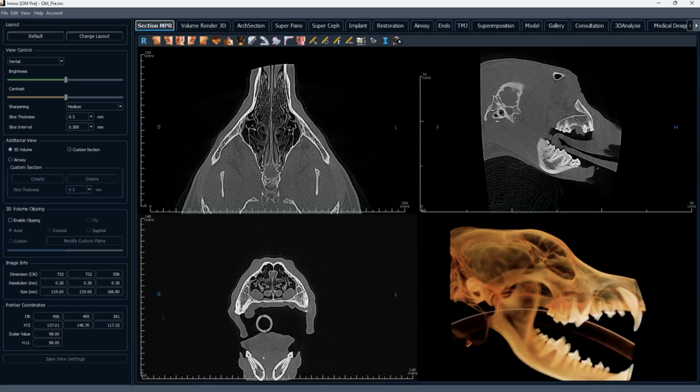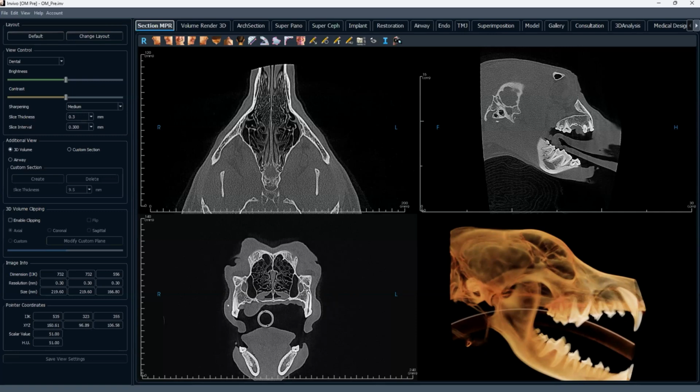It's sort of like the opposite of a dorsal rim excision in the mandible. It's like a ventral rim excision. And that actually works very nicely. And so that's what we did here. We also went back and went all the way to midline.